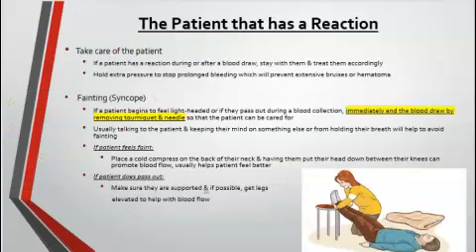Once in a while, a patient will have a reaction to a blood draw. In these cases, you just need to take care of your patient. You need to treat them accordingly depending on what's going on with your patient. If the patient is bleeding for a prolonged amount of time, you just need to hold extra pressure to help prevent excessive bruising or a hematoma. A hematoma is just another word for a bruise.